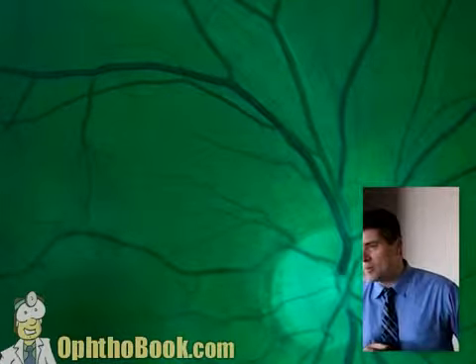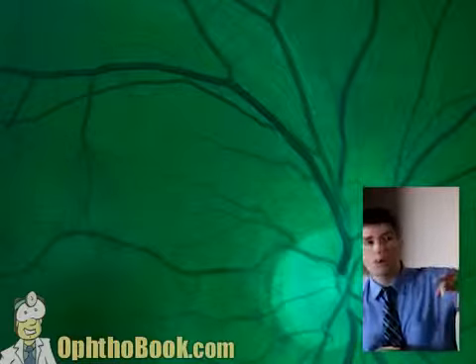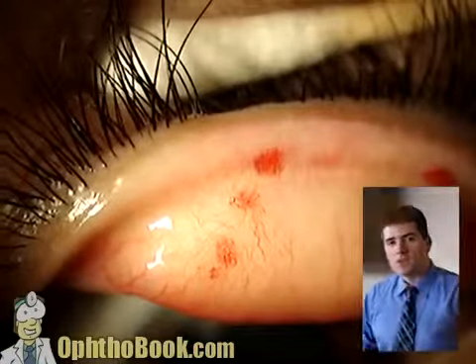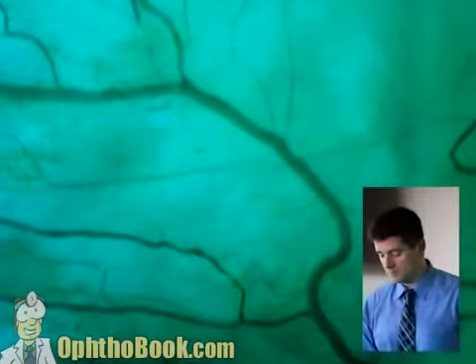When people have glaucoma damage, it's that nerve fiber that becomes damaged, and sometimes you can actually see a pattern of dark band right in the middle of that, which seems to correspond with any scotomas on their visual field. You can also use the red-free filter when looking at the surface of the eye. Red lesions are much easier to see with this light. They become darker, they become black. In fact, you can even see the individual blood vessels coursing through the surface of the conjunctiva if you use this filter and you turn your magnification up enough.